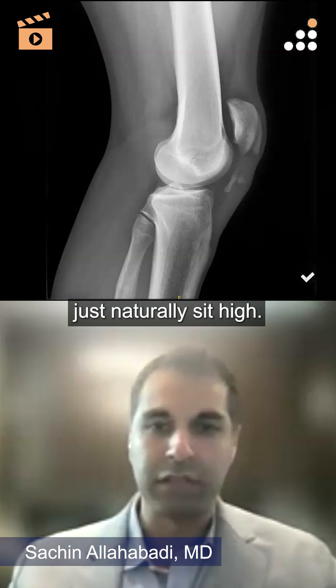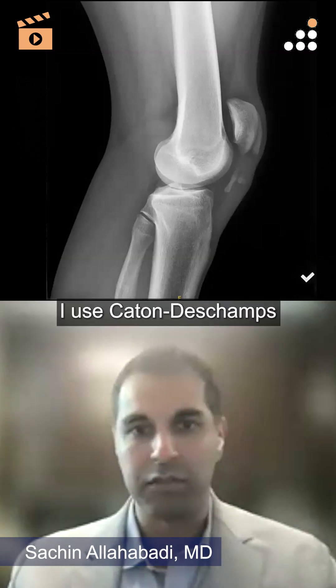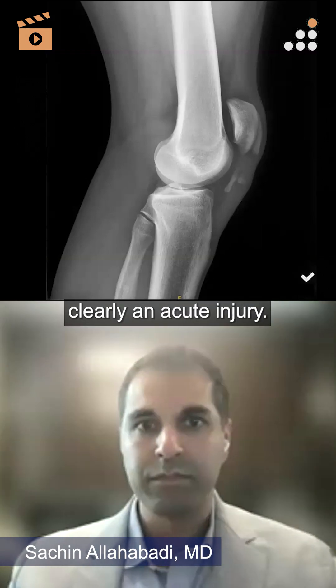But some people just naturally sit high. In general, I use Caton-Deschamps, and this is certainly clearly an acute injury.